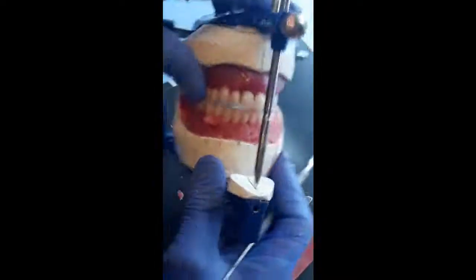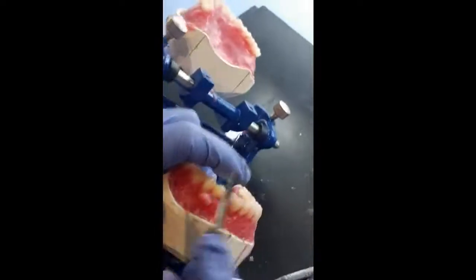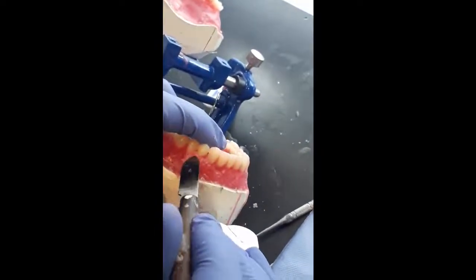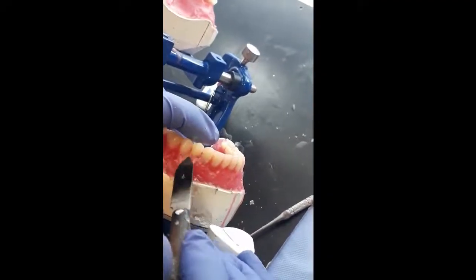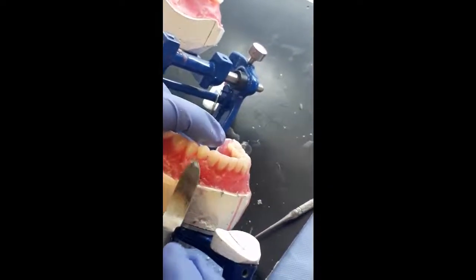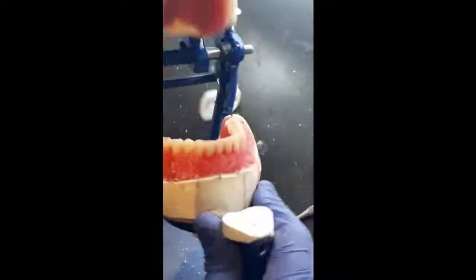You can see that here the tooth, I will fix it in its place, and we here can create the maximum intercuspation with the teeth together easily.